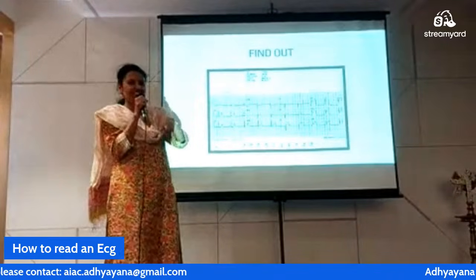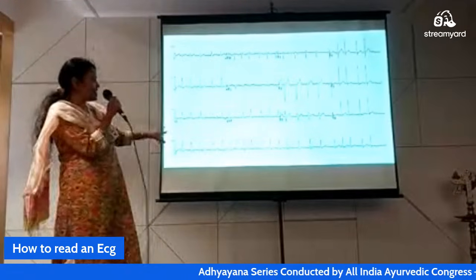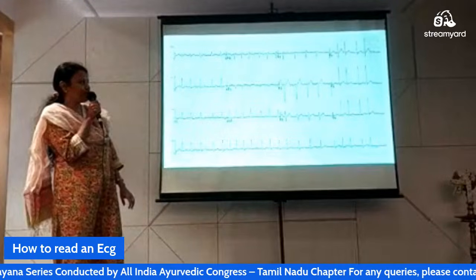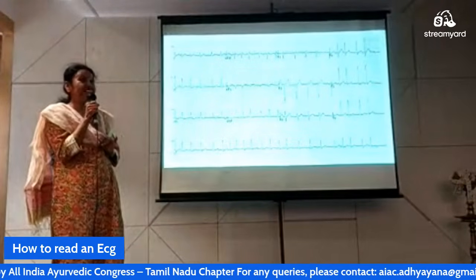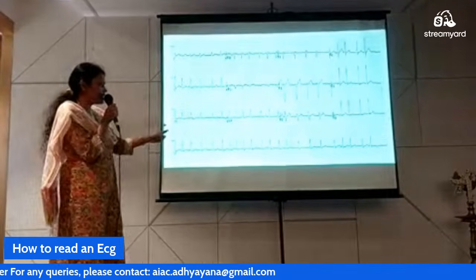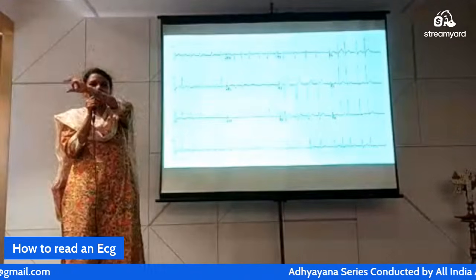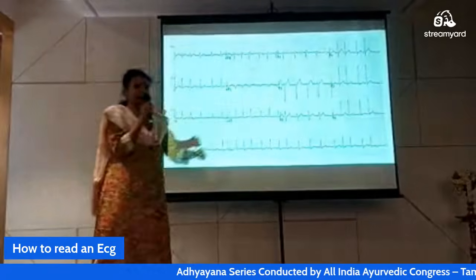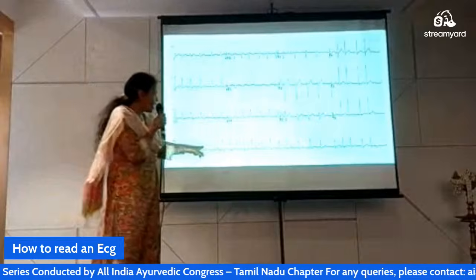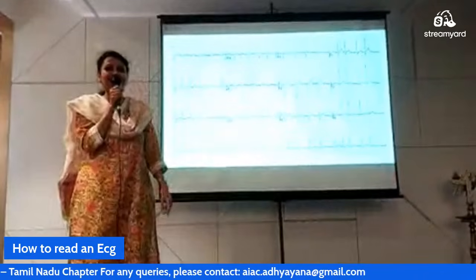Next one. Now tell me this. I'll give you a key. See lead 2. No, it's not sinus. It's not sinus at all. Just check, every P is having a QRS. Just check whether it's in an equal pattern. No, RR intervals are varied. Atrial fibrillation. See, RR interval small, large. Check.